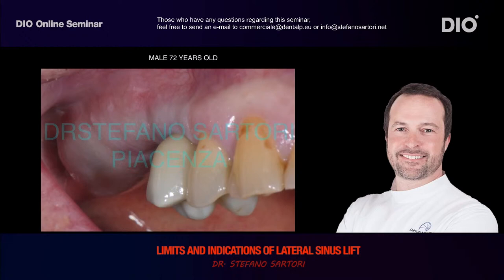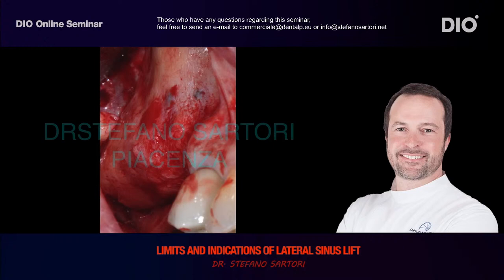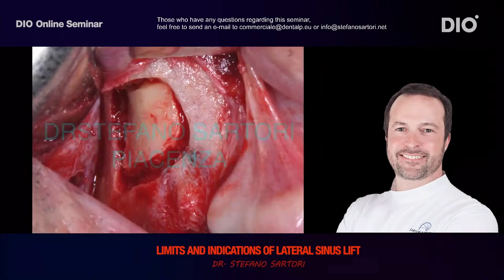This is another clinical case that's very important because I want to show you some situations in which our surgical procedure is complicated. As in the first case, the incision is crestal. In this case, the releasing vertical incision is made distal to the last element in the arch. The corticotomy in this case was very difficult to perform because of the presence of the septum inside the sinus. Septa inside the sinus, when they are thick, are very difficult to treat to remove the cortical plate of the maxilla, to have access to the sinus, to the Schneider membrane.